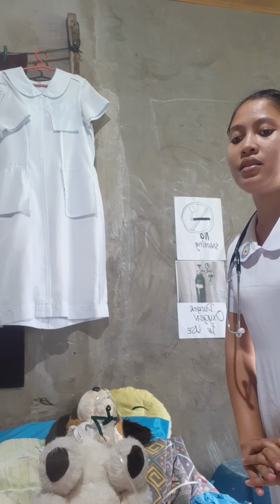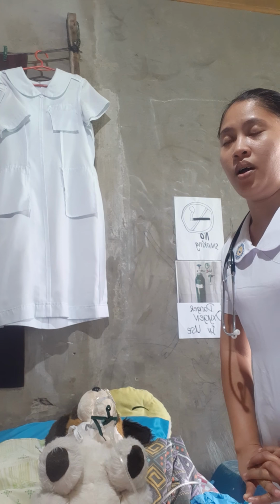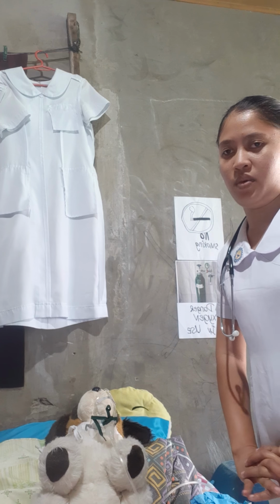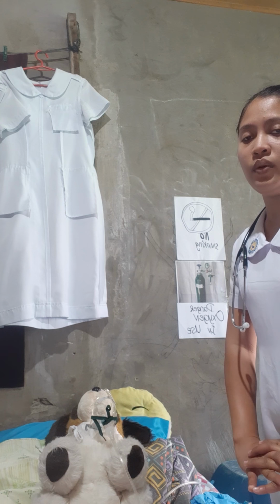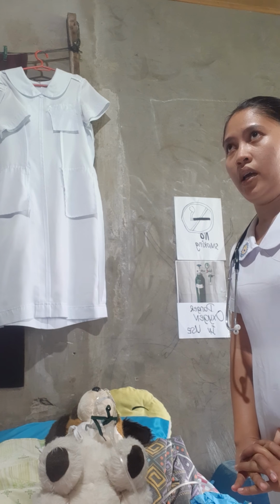So afterwards, determine the need for tracheostomy care. We need to assess the client's pain and administer pain medication before the tracheostomy care, if indicated only. Then we are going to explain to the client what we are going to do and the reason why.